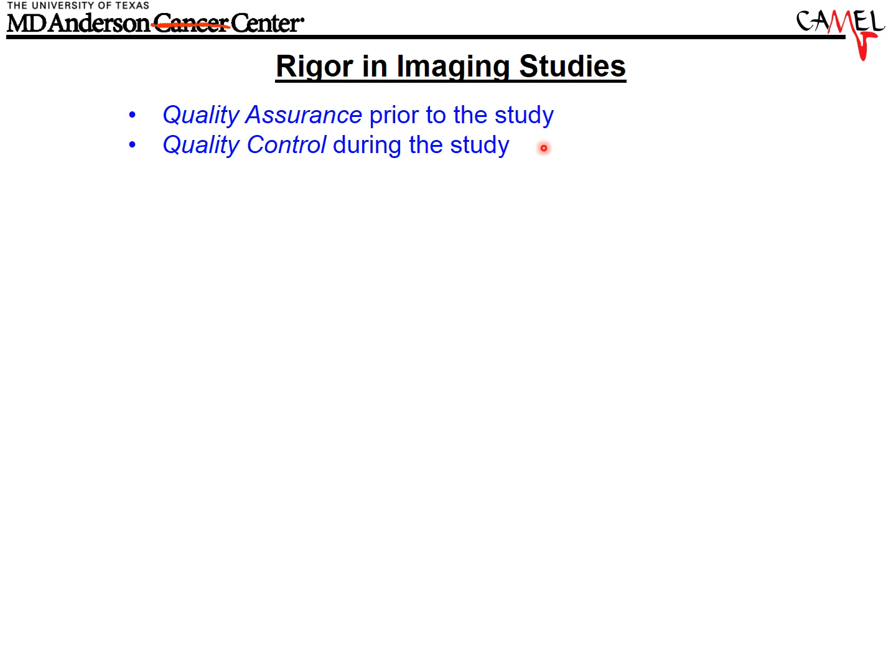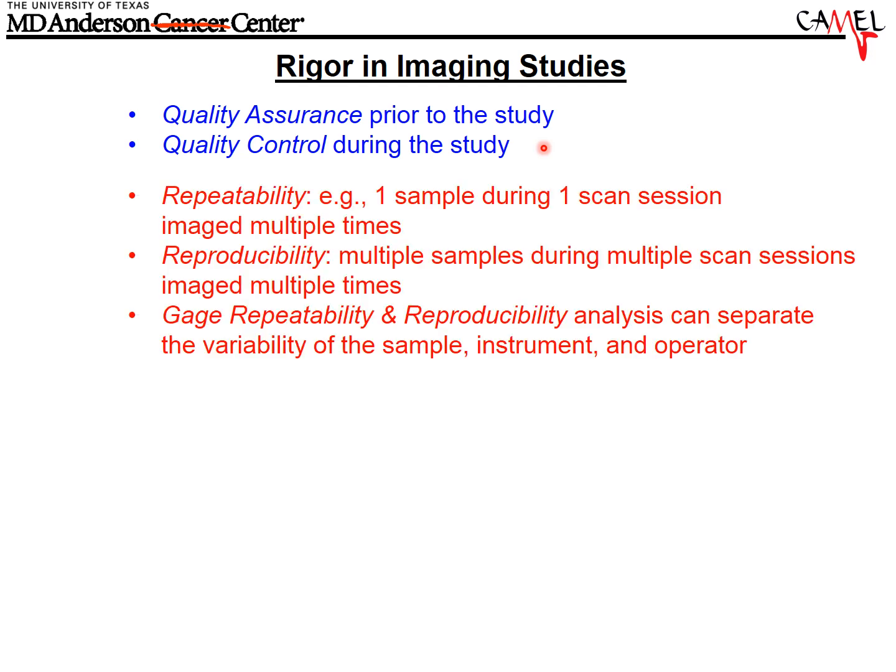And we don't do that in biomedical imaging. It is very rare for us to add an extra mouse just to check for QA/QC or to repeat a study with a phantom to ensure that our equipment is working well. And I think it's something that's good to keep in mind. Certainly in genomics and proteomics, the same sample is slipped in with all of the other experimental samples as a QA/QC when a contract research organization is analyzing samples to ensure good quality control. And we should think about that as well to ensure that we have good data quality for our analysis. Also, I'd like to just briefly mention that we very often do repeatability studies.